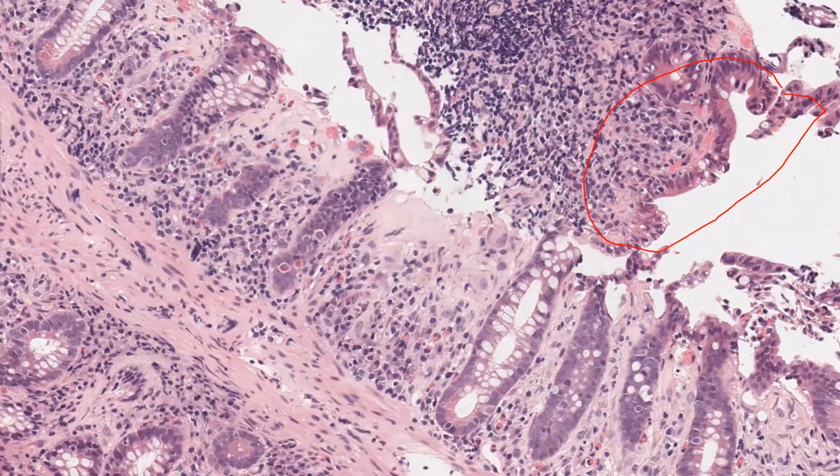And the registrars always come to me happy and excited, raising the flags: we found a case of collagenous colitis. Why? Just because they saw some pink stuff present under the subepithelial plane. And then I send them away disappointed, in utter sadness and sorrow, only because before I put a diagnosis of lymphocytic colitis or collagenous colitis as a microscopic colitis, the golden rule is that you have to have a chronic inflammation first in the lamina propria, right?